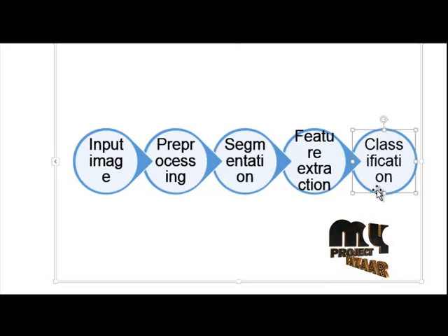And the second one is neuro-fuzzy ANFIS, an adaptive neuro-fuzzy inference system based on an artificial neural network. This is also a supervised learning model.